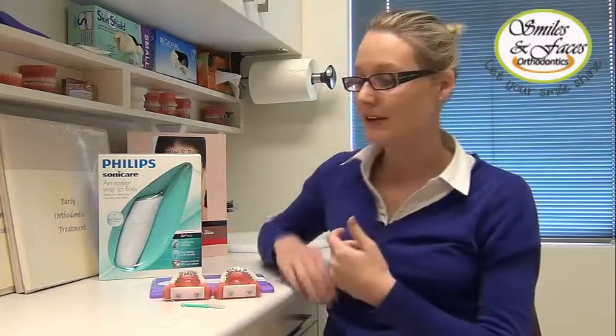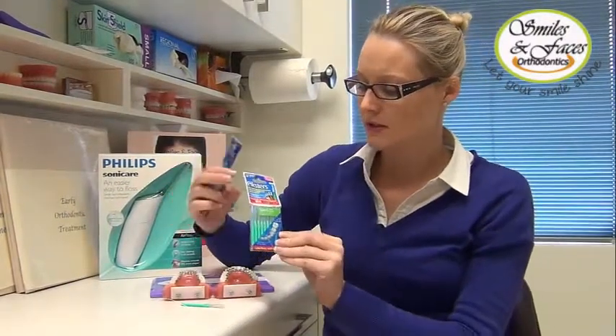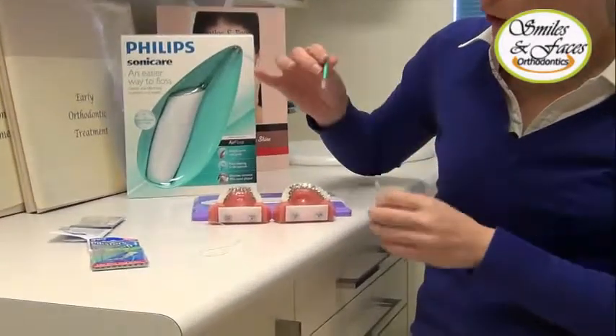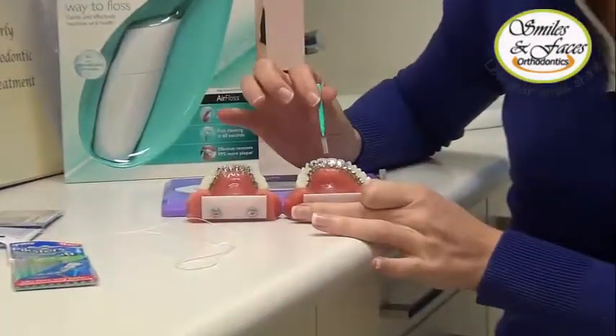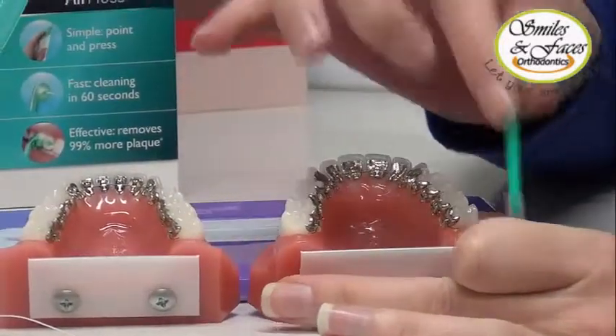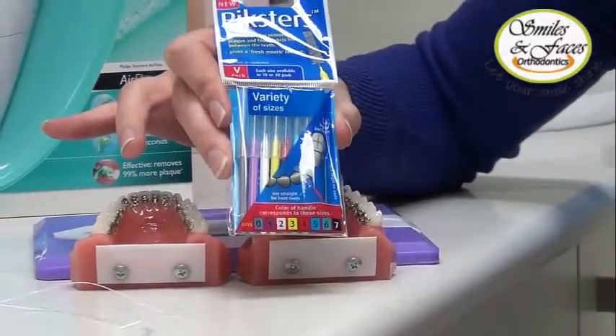Another factor of lingual braces I'd like to address is oral hygiene. It can become difficult and fiddly to effectively clean around the braces, especially the part closest to the gum. I suggest the use of pixters, which you can purchase here. We recommend the green pixter, which basically helps to clean under the wire and next to the brace. If you find this one difficult, you can try different sizes from a variety of packs which come bigger and smaller.